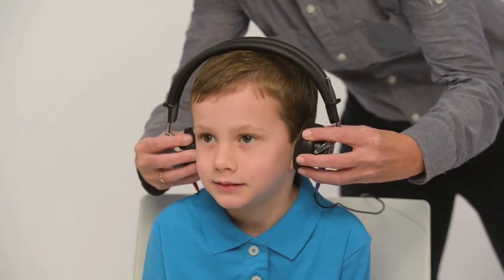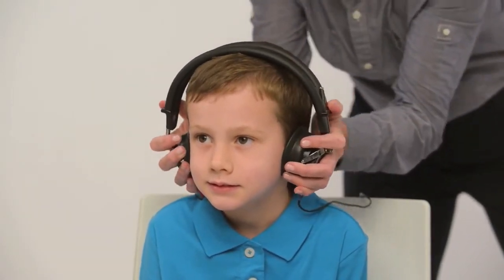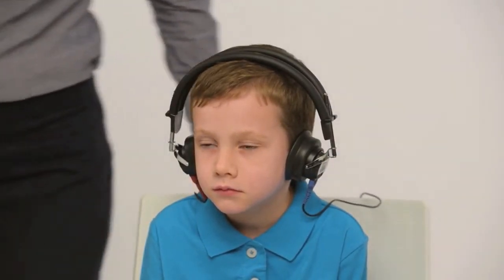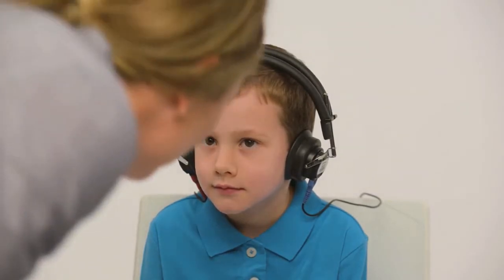Place headphones directly over the child's ears with red phone on the right ear, blue on the left. Remove any obstructions that may interfere or be uncomfortable, such as glasses. Adjust the headband so the headphones are centered over the ear canal.